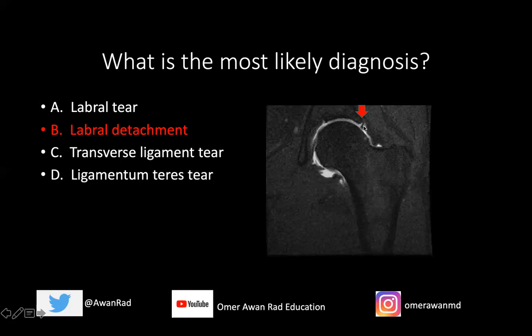The labrum itself is not torn, but this is a case of labral detachment because the labrum should be situated at the labral-chondral junction. Instead, we have contrast imbibing between the cartilage of the acetabulum and the labrum itself, which we should never see. The fact that contrast extends at the labral-chondral junction, separating the bone and cartilage of the acetabulum from the labrum, indicates a labral detachment.